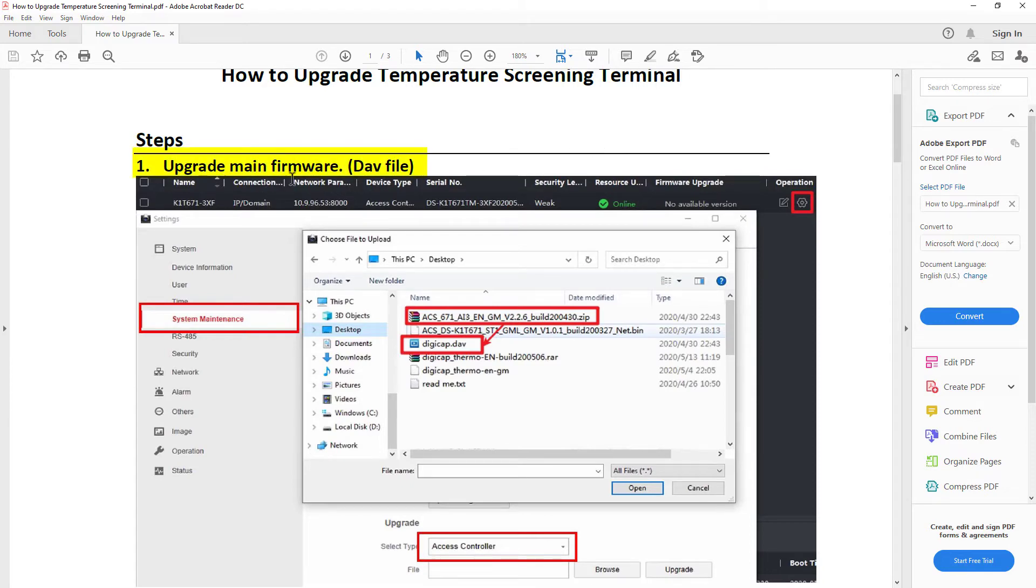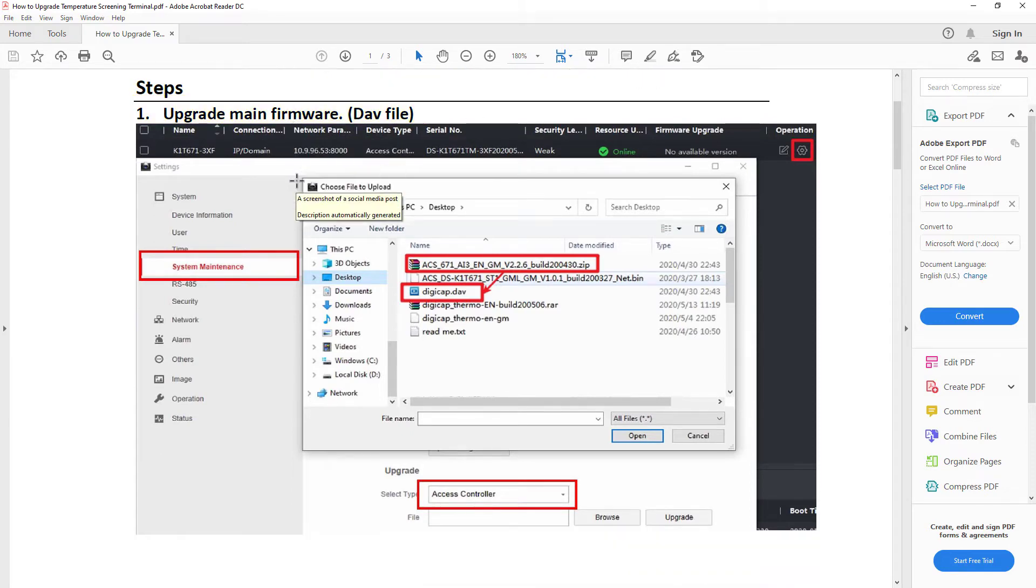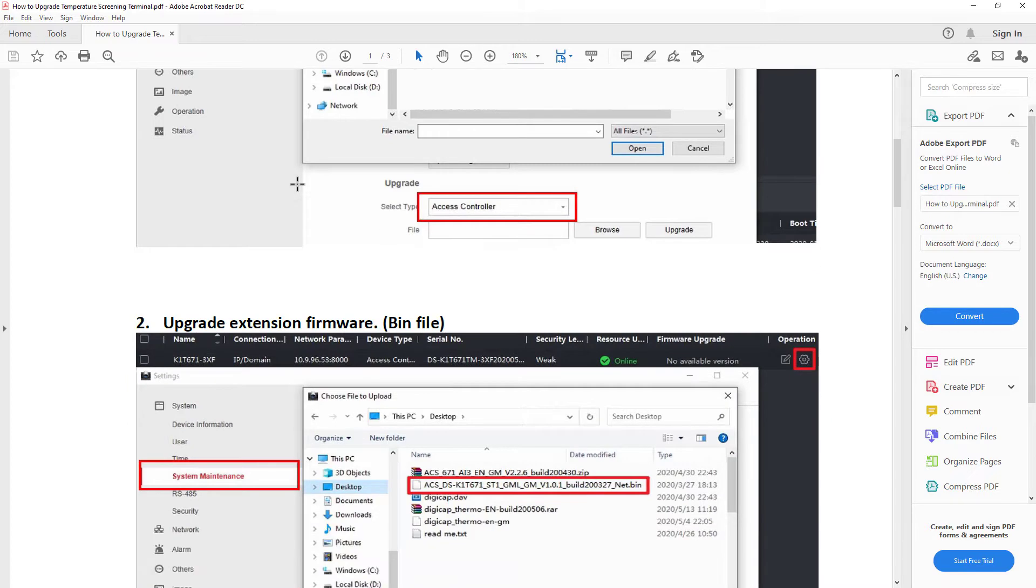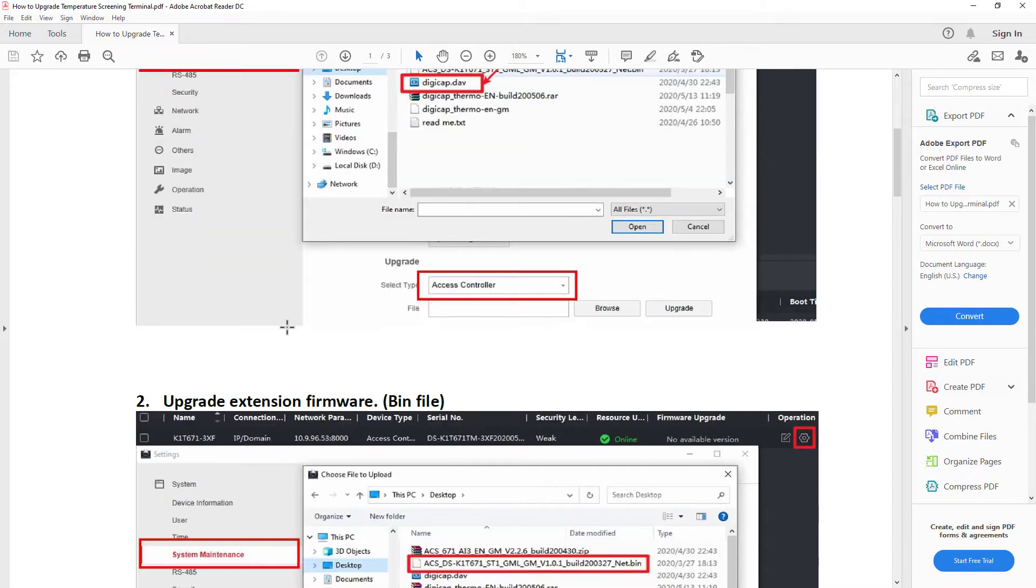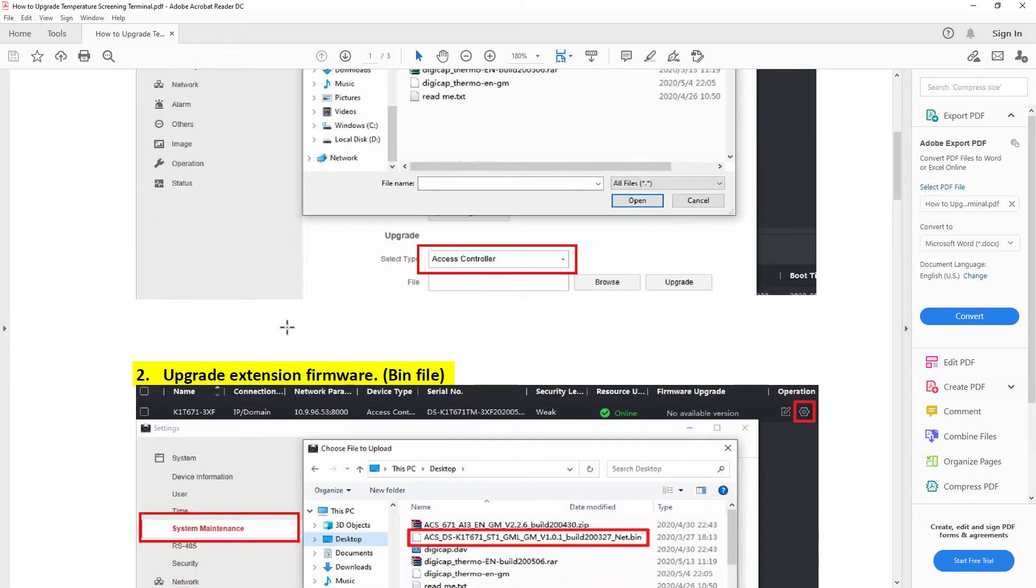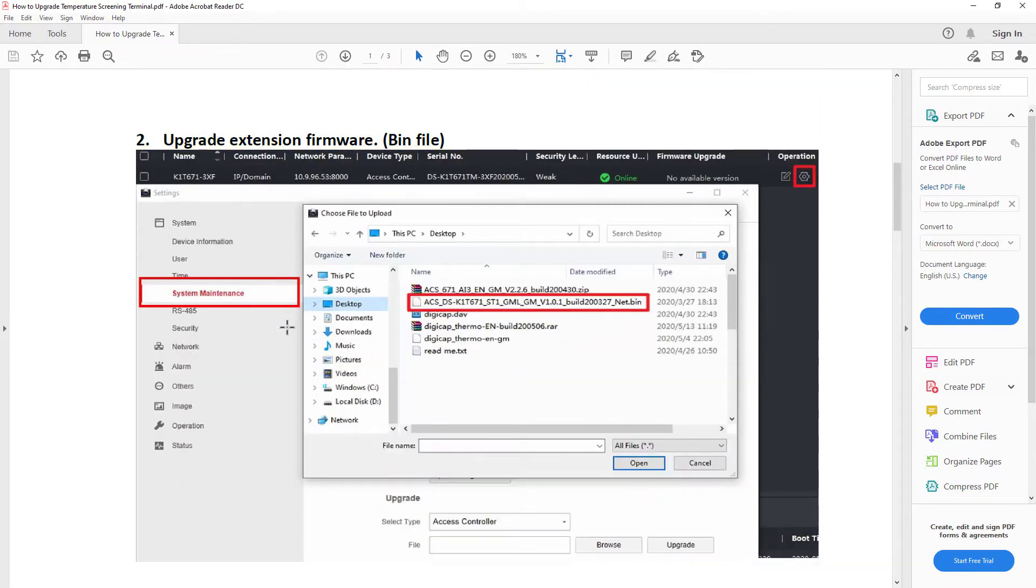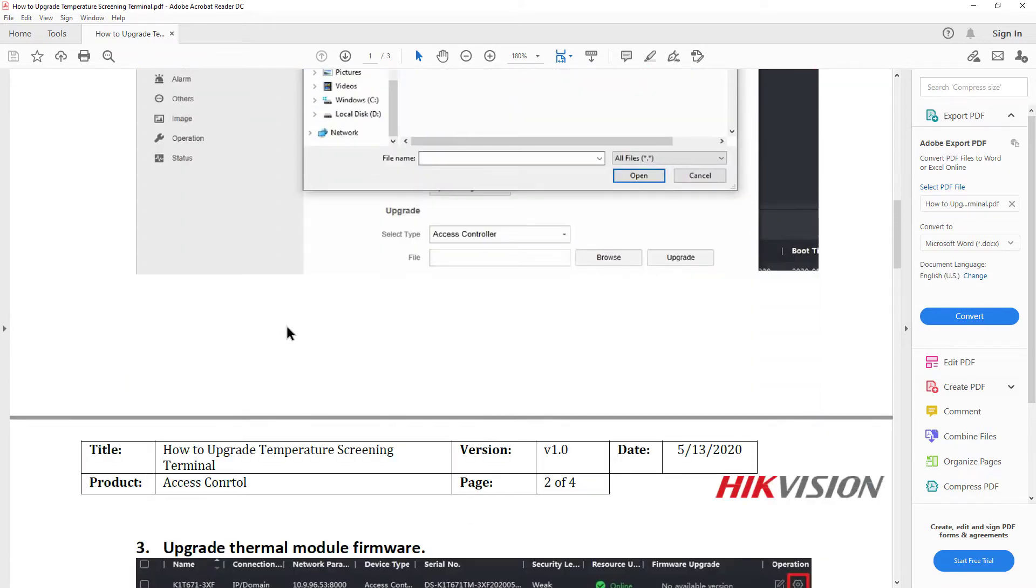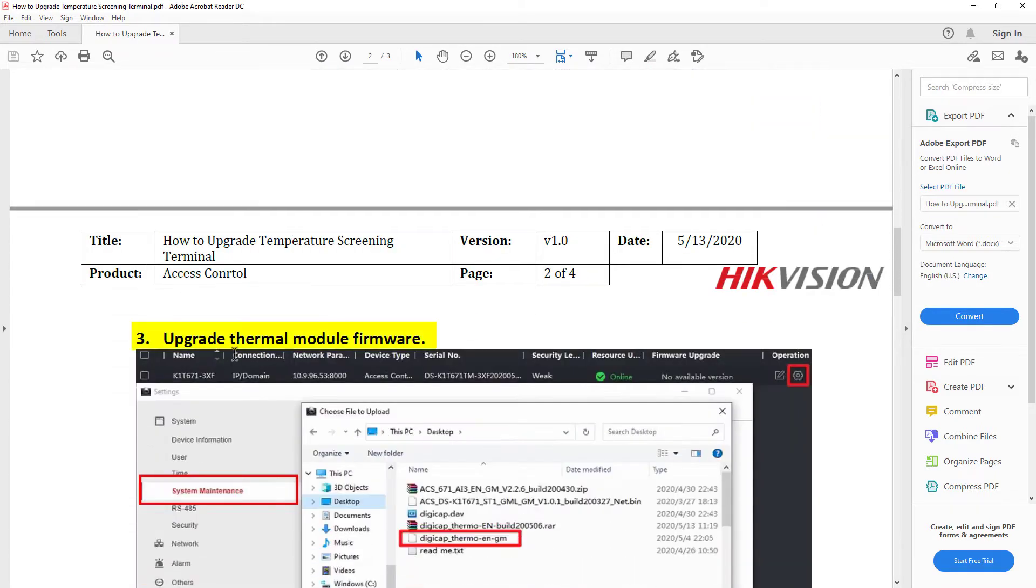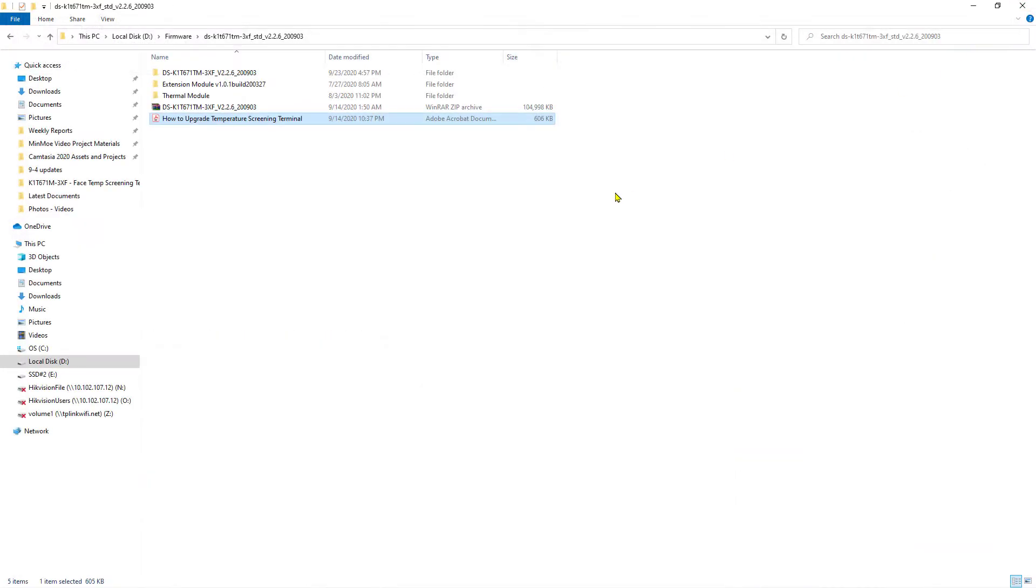We're going to upgrade the main firmware file first, then we're going to upgrade the extension device, and then finally we're going to upgrade the thermal module. It also shows you which files go with which type of device. However, the device is pretty smart, and if you try to use the wrong file with the wrong part, it's going to warn you about that.